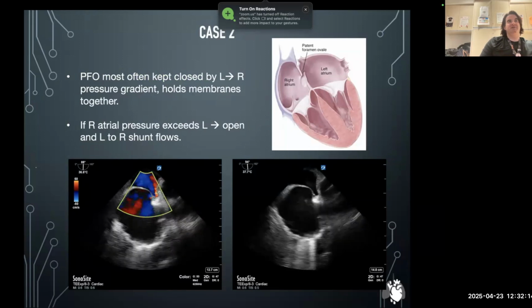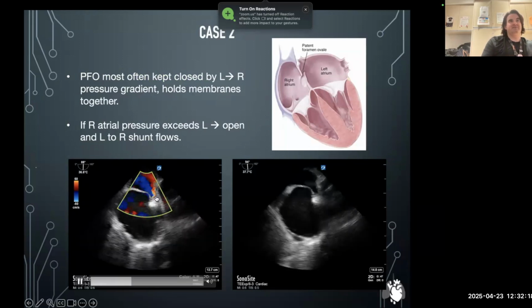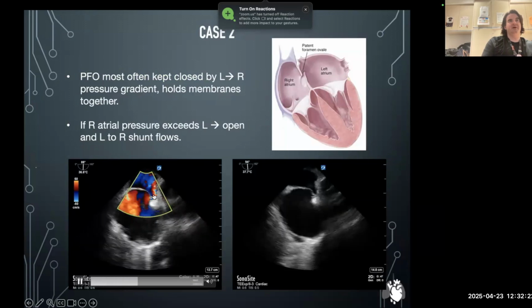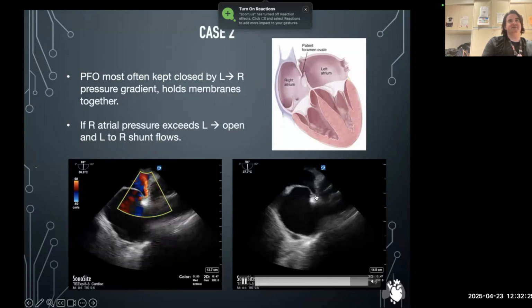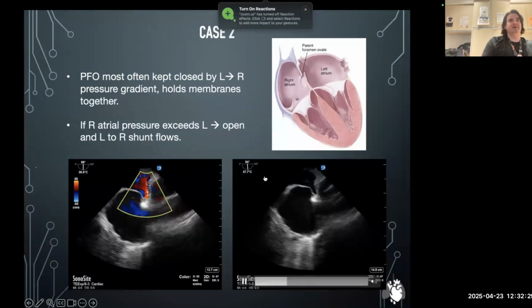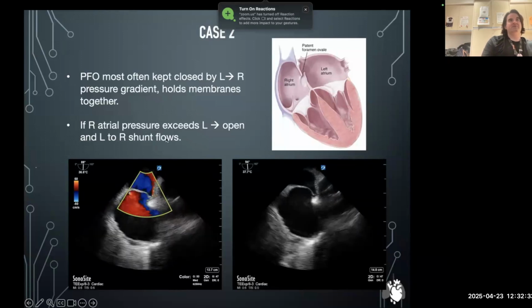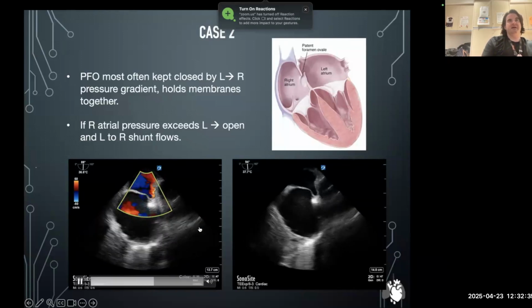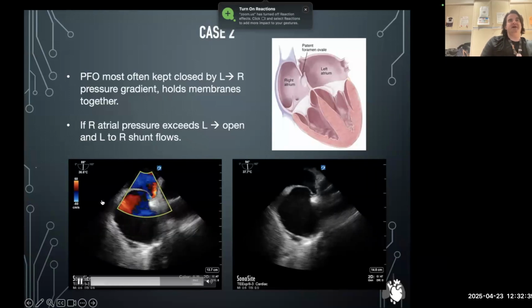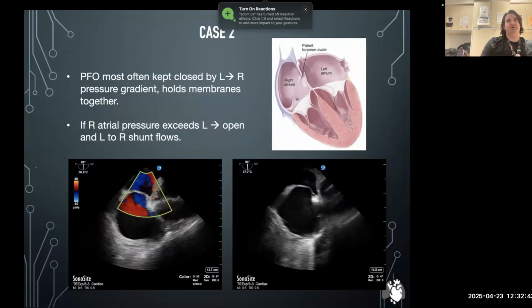And sure enough, you can see that small continuous leak on color in the bottom left. This is on the roof of the intra-atrial septum, very commonplace, a bit of a tunnel PFO there. You can see it leaking continuously. In fact, you can see that it's not contiguous. There's a small perforation there. Okay, that's probably not the correct term, but discontinuity. So if this opens, it will start leaking. Okay, that's the one problem with these patients. Sometimes hypoxia and refractoriness to oxygen therapy with the PE may suggest they have another problem.